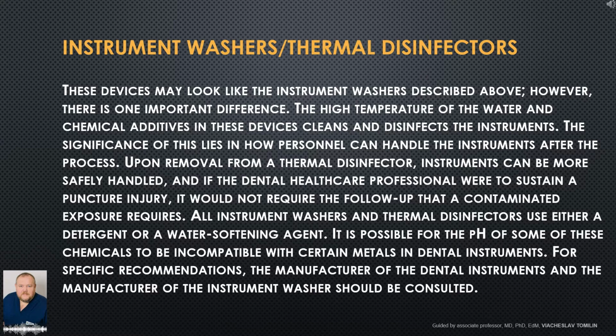The significance of this lies in how personnel can handle the instruments after the process. Upon removal from a thermal disinfector, instruments can be more safely handled, and if the dental healthcare professional were to sustain a puncture injury, it would not require the follow-up that a contaminated exposure requires.